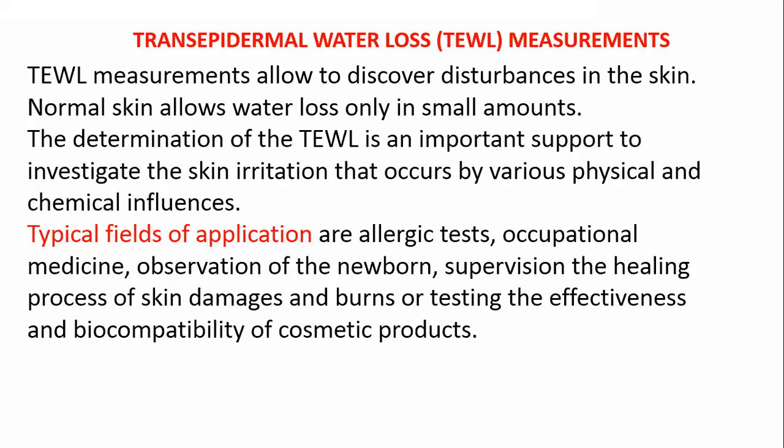The typical fields of application of this instrument include allergic conditions, various skin problems, observation of newborn skin, supervision of the healing process of skin damage, burning cases, checking effectiveness of various products, and biocompatibility of various cosmetic products. Whatever products we are utilizing for skin care purposes may affect the loss of water from the skin, so how much water is lost can be measured using this instrument, allowing it to be used for various purposes indirectly.